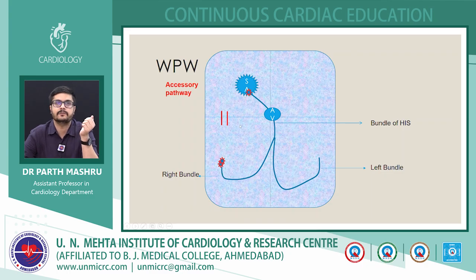The accessory pathway does not always have decremental properties like the AV node. So as soon as the P wave ends, the ventricle starts exciting. This is exactly what is meant by pre-excitation: the accessory pathway leads to excitation of the ventricle before the AV node.